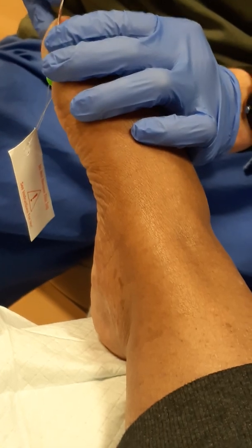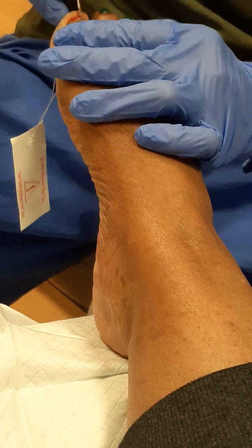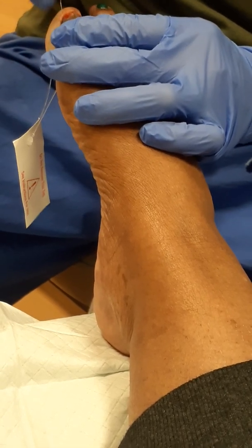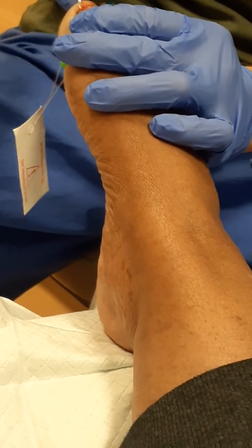All right, don't miss out, okay? Just loosening up all the corners. Tight around the corners. Yeah. You don't want to rip out any extra skin when you rip the nail off. Does that make sense? You want to make sure it's all the way freed up.